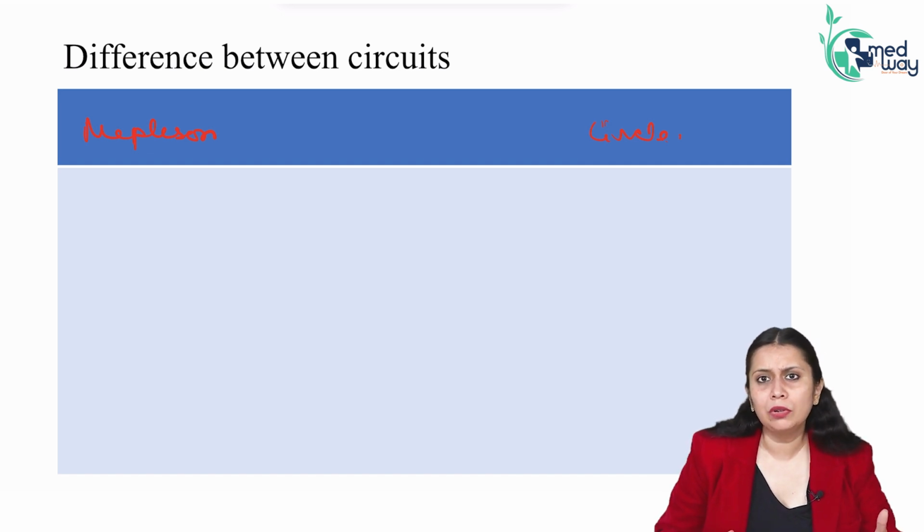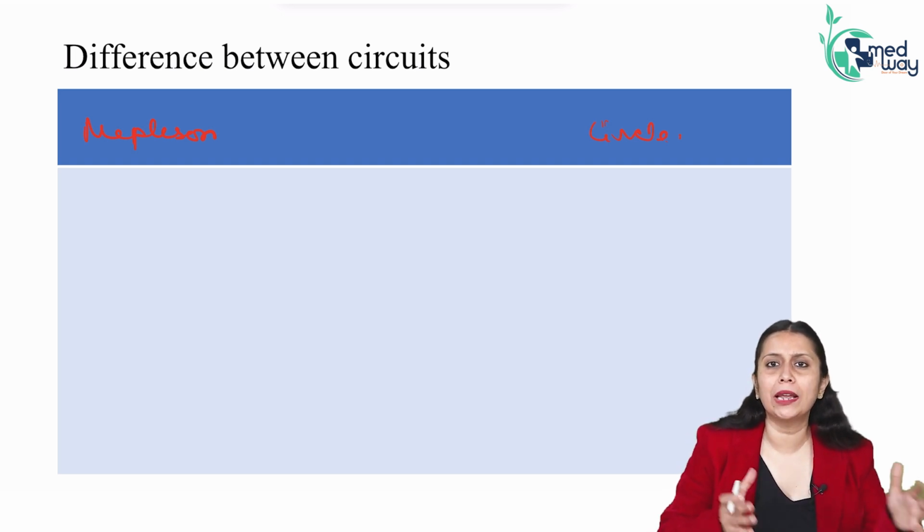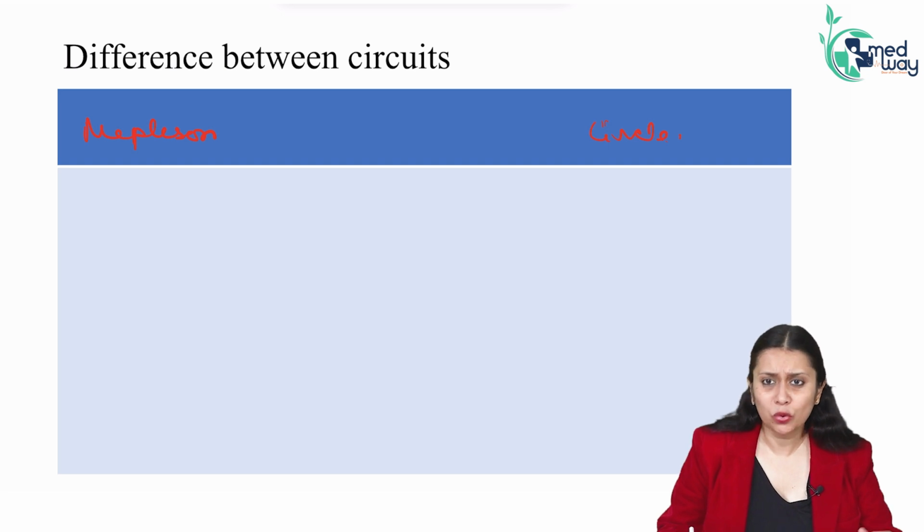So if I have to take a patient on circuit from one place to another, and I don't have an option and only have circle system, I'll have to move the entire anesthesia machine along with the patient, which is very cumbersome. So we need a portable system, and Mapleson system is still in clinical use because of its portability. It is a lightweight, simple circuit which can be taken from one place to another. It can be used for giving distant place anesthesia. Its portability has retained its use.